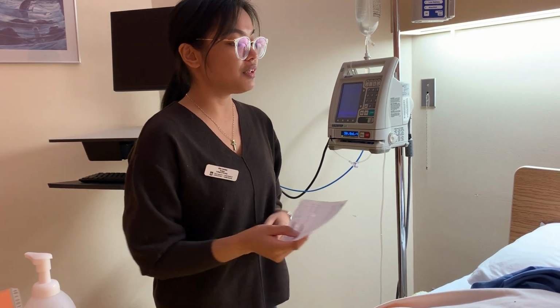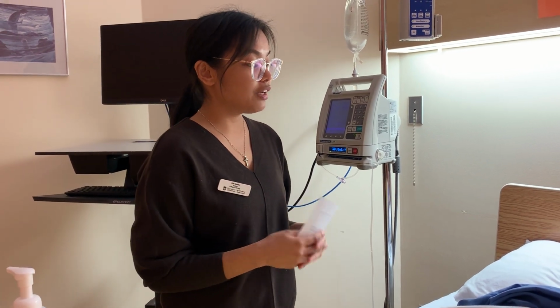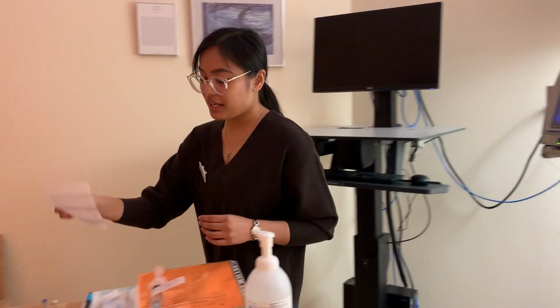At this point, the patient can refuse. Would you like to take this medication today? Yes, so they did not refuse. Now I can go ahead and prepare my items.